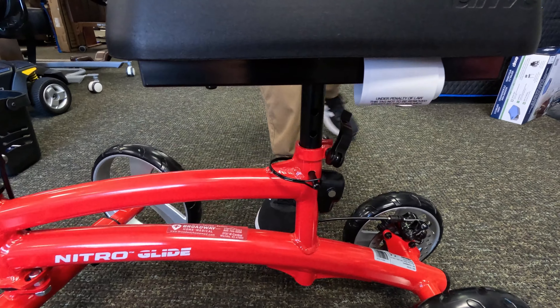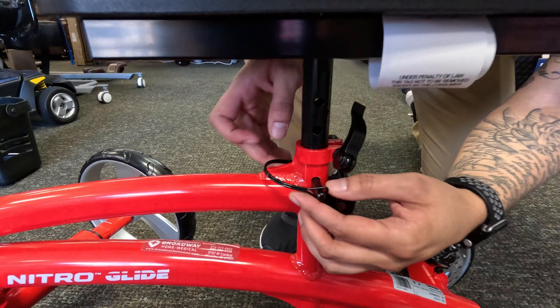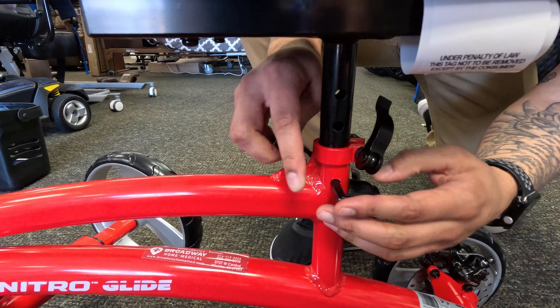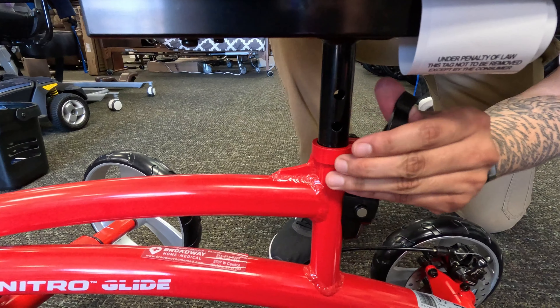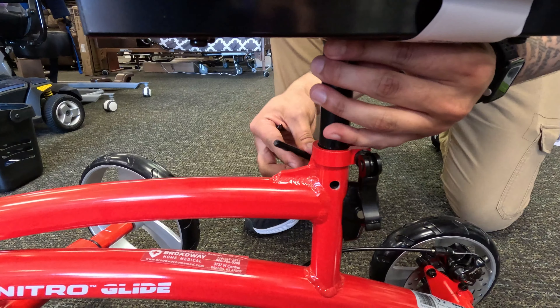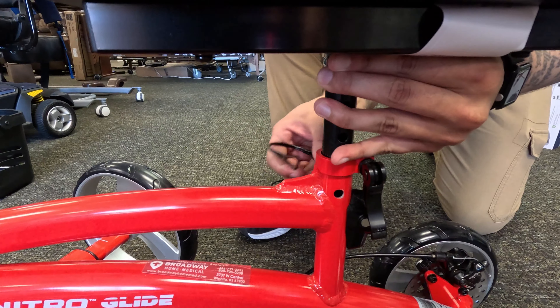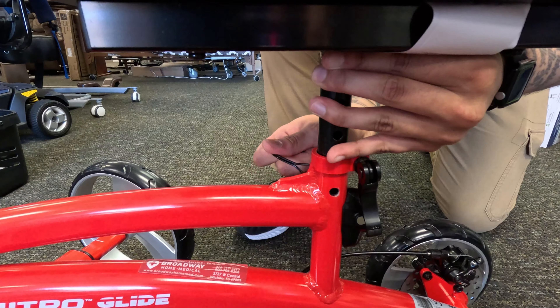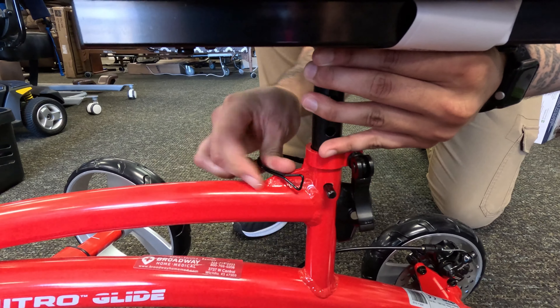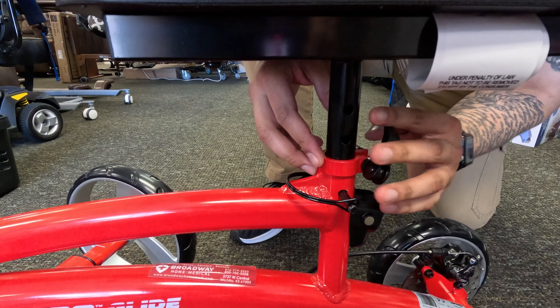Now we're going to go ahead and go to the seat. This is adjustable for whichever knee you need it to be for. What you're going to want to do is just release right here, pull this out, and unlatch that. Get it to the desired height that's needed, then put it back into the hole from there, and lock that out.